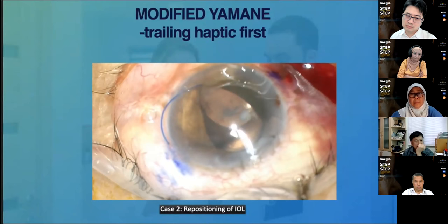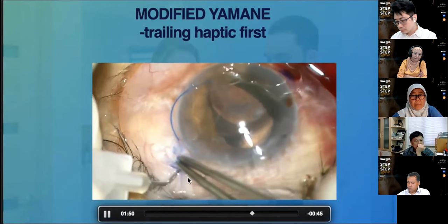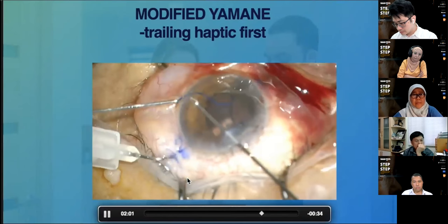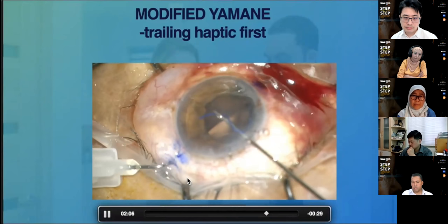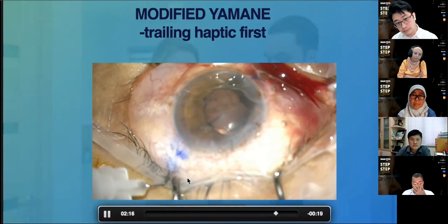Now, as you can see, I keep injecting the viscoelastic because every time before you start to manipulate the eye, we always need to make sure the eye tension is good so that you will not get into trouble during the manipulation inside the eye. So we are pushing back the leading haptic inside using the handshake technique, passing the haptic from one forceps to the other, and threading in the leading haptic to the needle and externalizing it safely.